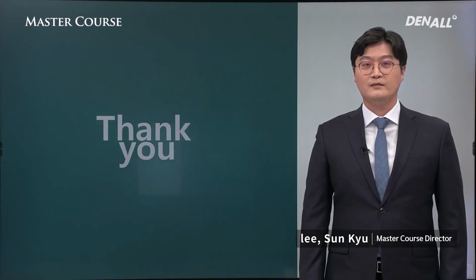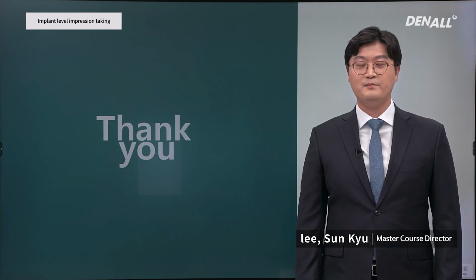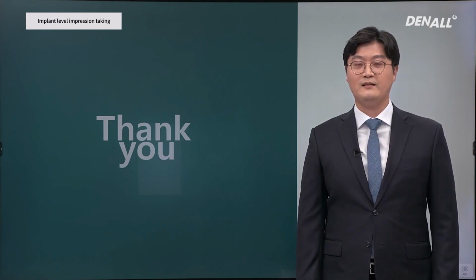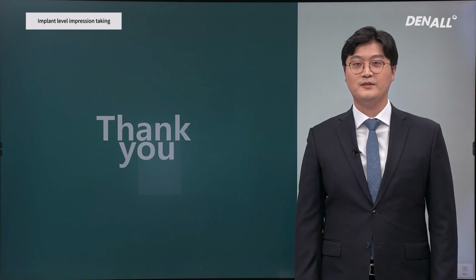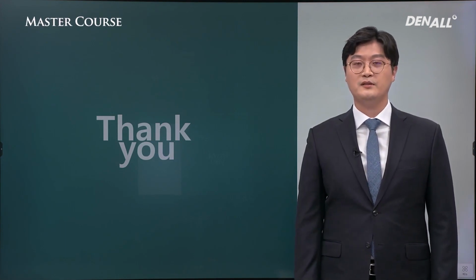In this online course, I briefly talked about implant level impressions. In the offline master course, more detailed implant level impressions will be explained through hands-on. Accurate implant level impressions will be explained.